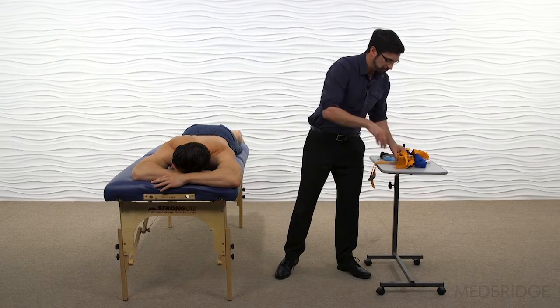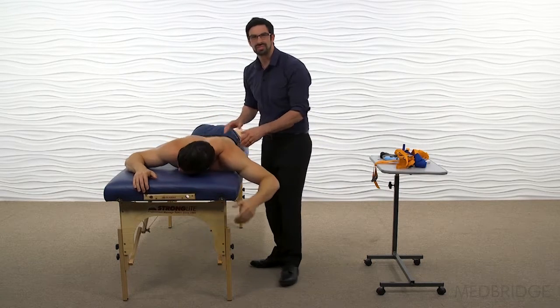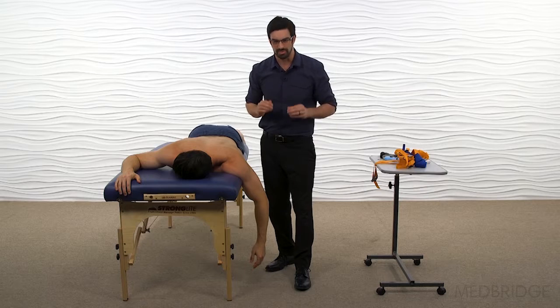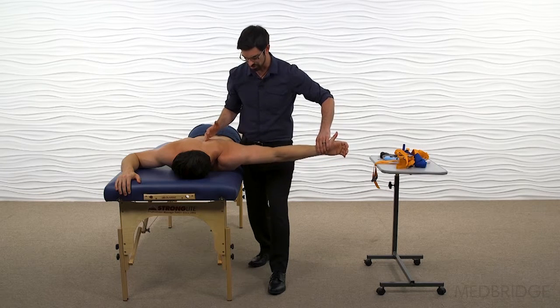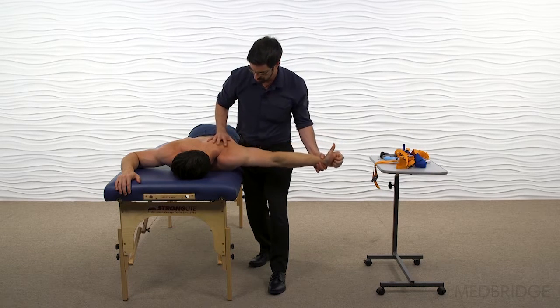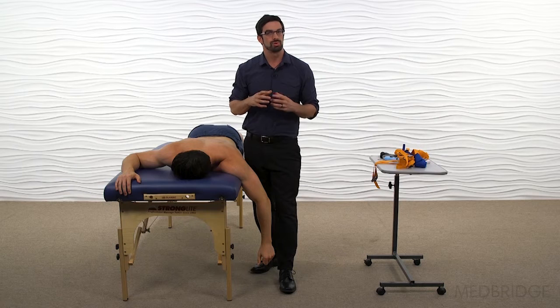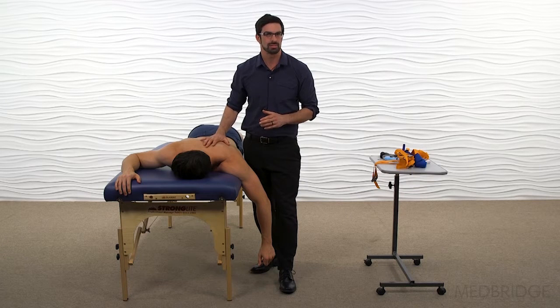The patient is going to be in a prone position on the table. Aaron, go ahead and scoot just a little bit towards me — we're going to move slightly to the edge. They're going to turn their head to the contralateral side and be placed in a pre-testing position, with the arm brought into external rotation. You can see Aaron has a little difficulty getting into full external rotation, so I can test him in full humeral external rotation, in a neutral humeral position, or both, to see the difference. For patient convenience and comfort, I'm going to test him in neutral.